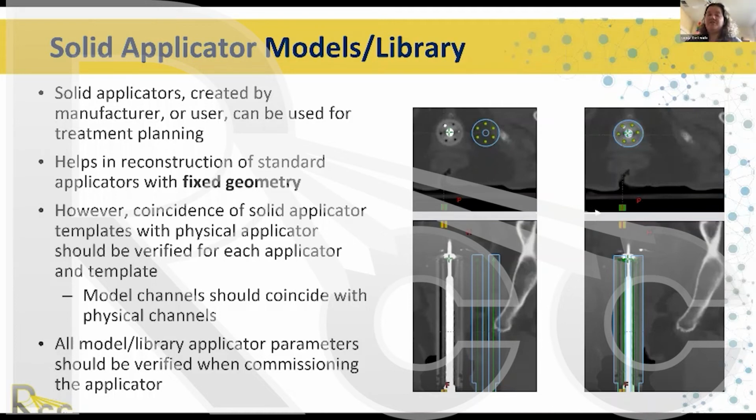I actually have another story about that. It also happened last Friday. I had a very interesting Friday on my brachy system. We used an applicator that was new for us, and when the dosimetrist pulled in the applicator from the library, the dosimetrist actually grabbed the incorrect one, and there was a 1 centimeter difference. And they called me and said, hey, the applicator doesn't agree with the dummy wire. And I came in and we immediately saw what the issue was and put the correct applicator in.